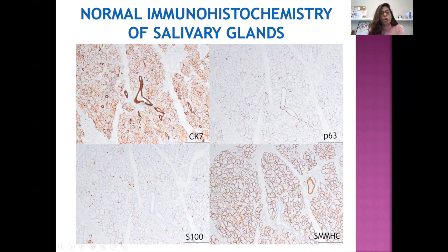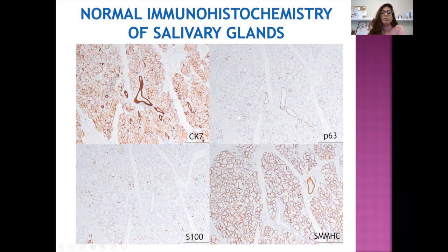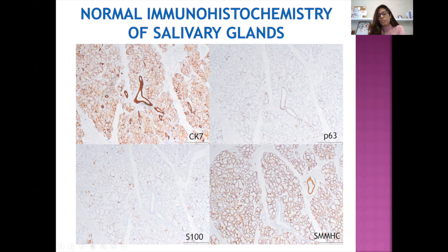Beginning with CK7, you can see strong ductal or luminal expression in the large excretory duct and striated ducts, and weak expression also in the acinar epithelial cells. P63 highlights both basal cells at the base of excretory and striated ducts, as well as myoepithelial cells lining the acini and intercalated ducts. S100 and SMMHC both help highlight myoepithelial cells — SMMHC nicely shows the rimming of acinar epithelial cells by myoepithelial cells, while the excretory duct is negative.